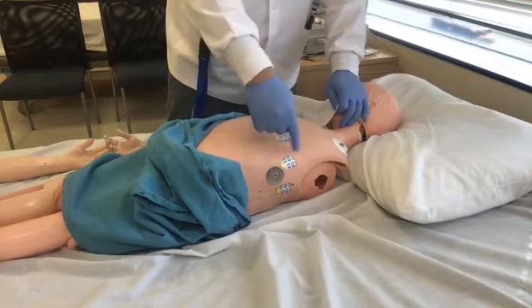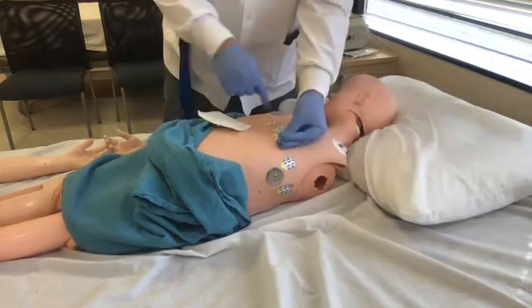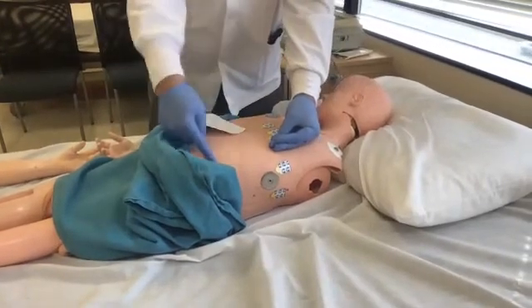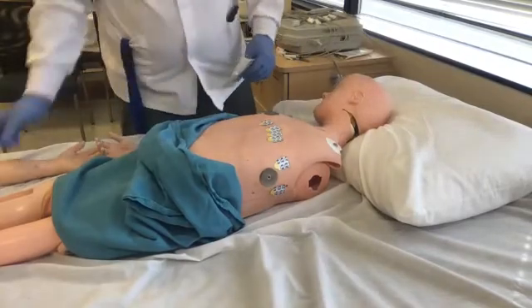Remember, these things are cameras. Typically, where's your heart? It's here. Where should these cameras be pointing? Here. But there are other machines, like I said. Now let me show you some variations. Where's his arm? Okay, just put it right there.